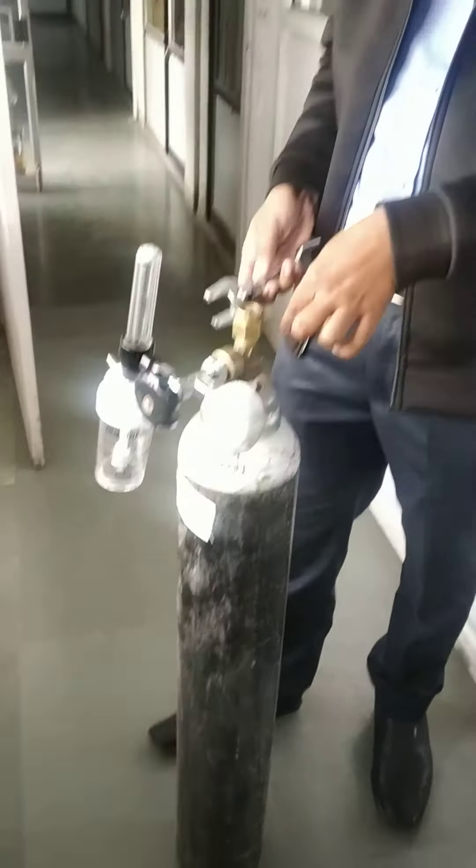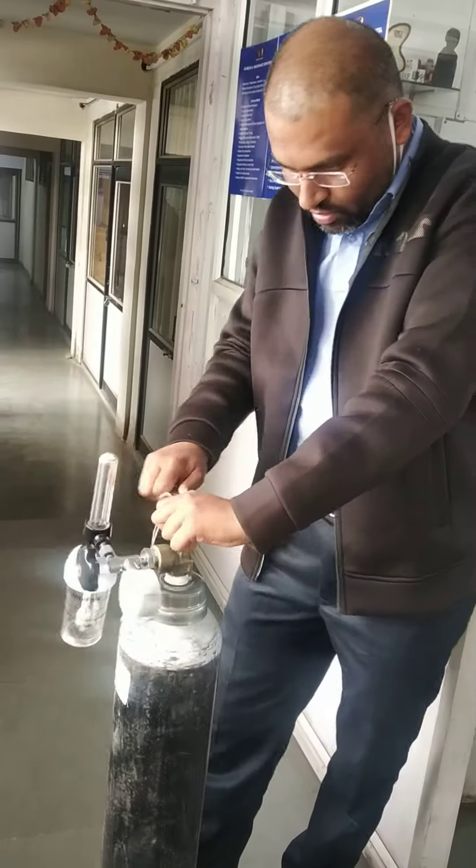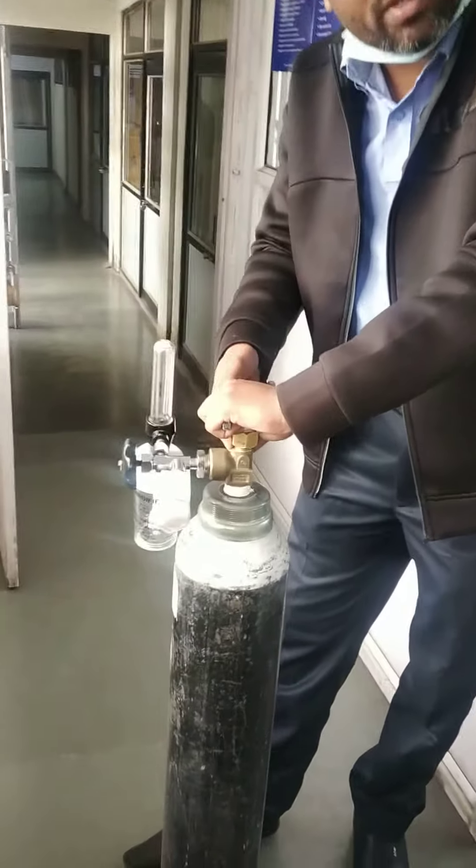One side is open and one side is close. You can open and close the valve.